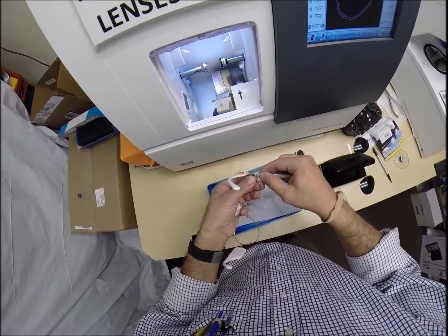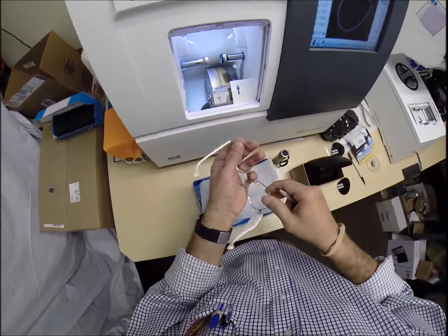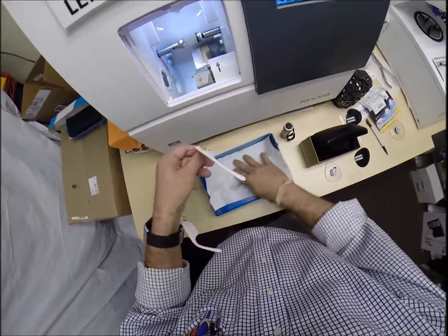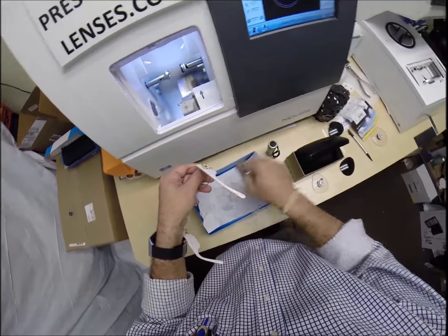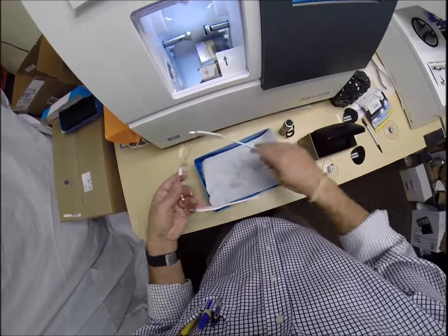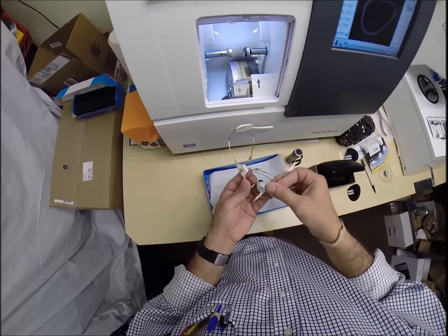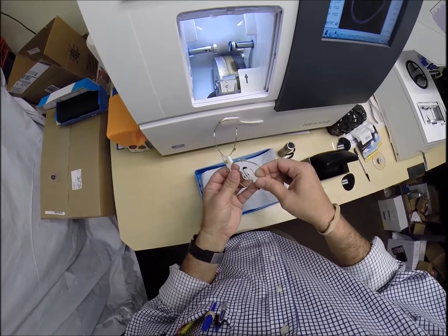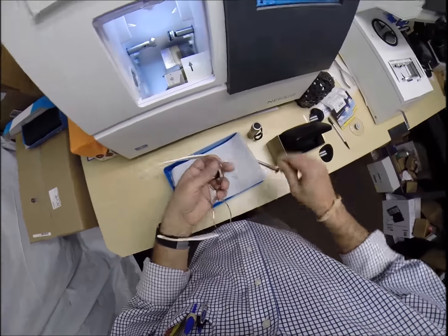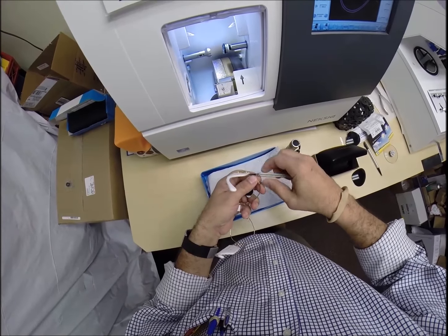And I've loosened it just enough that I can, and I hold the screw head up. I don't do it like this where the screw could fall out. The reason why I put something soft underneath is if the screw falls out, I don't want it to bounce and then take off. A t-shirt in a baking pan will absorb the blow. But again, with the frame upside down, I tuck the lens in the outside corner and then push it in. It snaps right in. After that's done, I'm going to tighten the screw back.